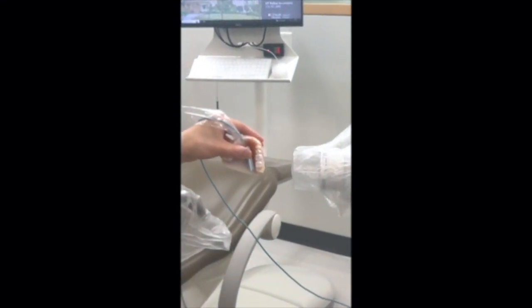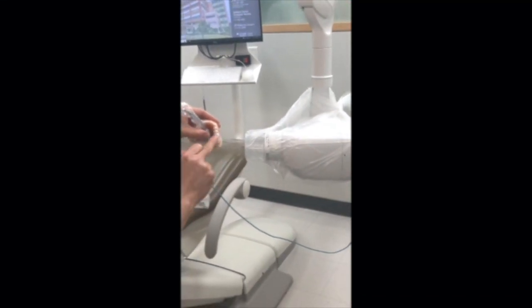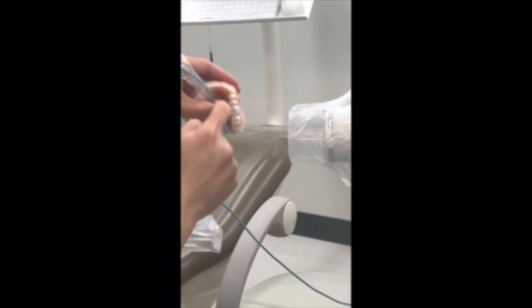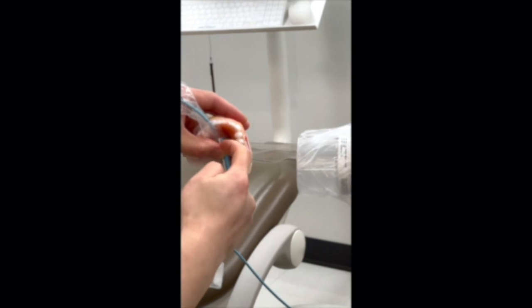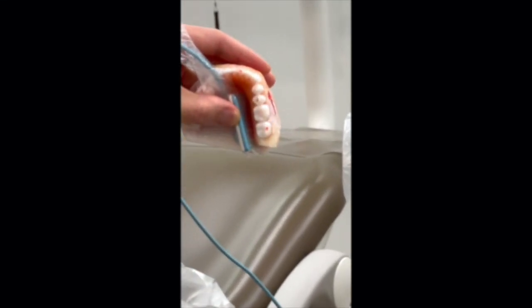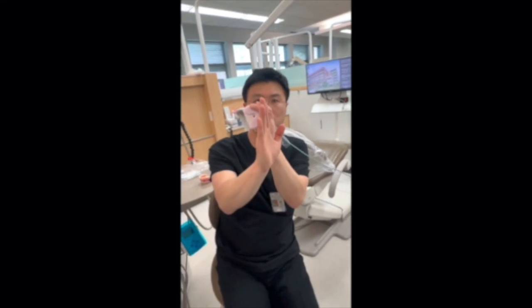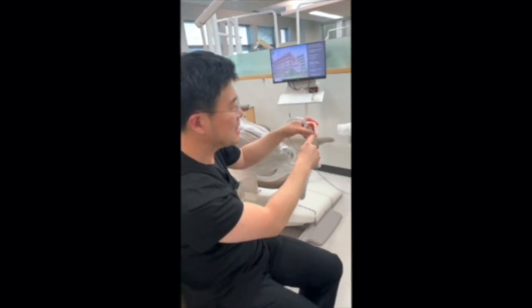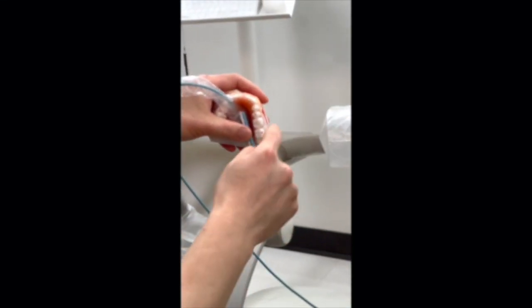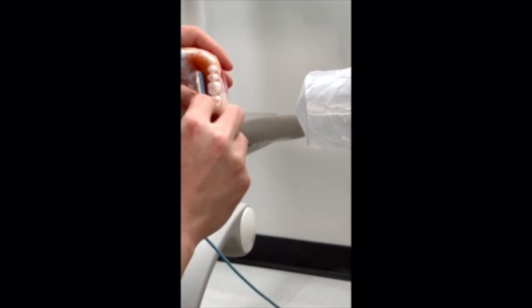By shifting the X-ray tube, where you had the mesiobuccal in the initial image, this will allow it to overlap from the mesiobuccal to the mesiolingual, and whichever direction that you moved the X-ray tube, you're able to determine which one is the mesiobuccal versus mesiolingual.